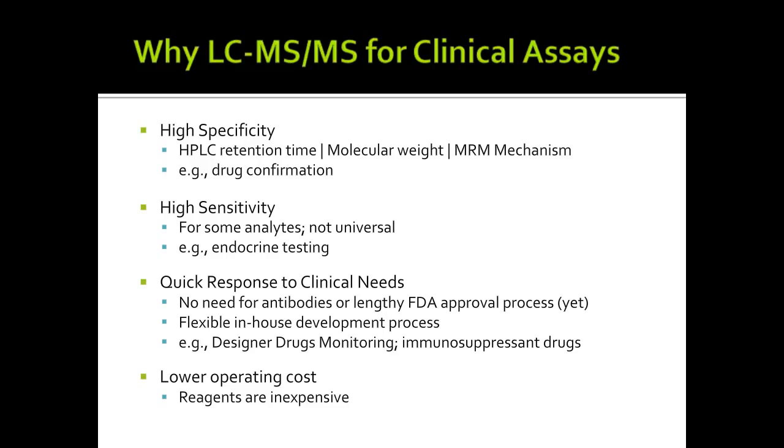The high specificity comes from a few factors. One is the HPLC retention time. Also, we have molecular weight. We also have the multiple reaction monitoring mechanism that enhances the specificity of identification. One example is drug confirmation, where immunoassay cannot differentiate similar compounds, but mass spec can.